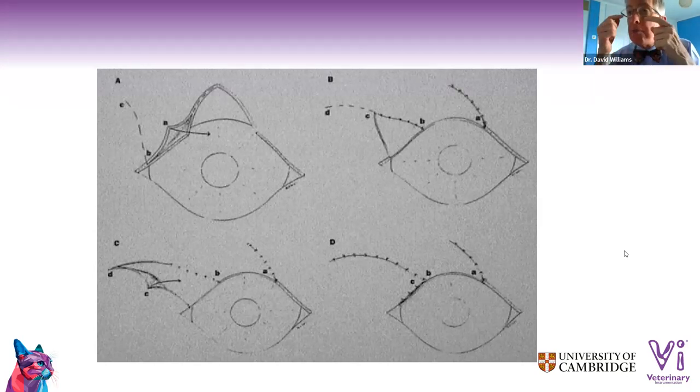In fact, there is a punctal plug that's used in people. We did try it in dogs, to plug the lacrimal punctum in people with dry eye, and it would work in these little dogs as well, if you blocked off their lacrimal punctum to give them more lubrication on the surface of their eye, when they're just going to be evaporating all the surface there.